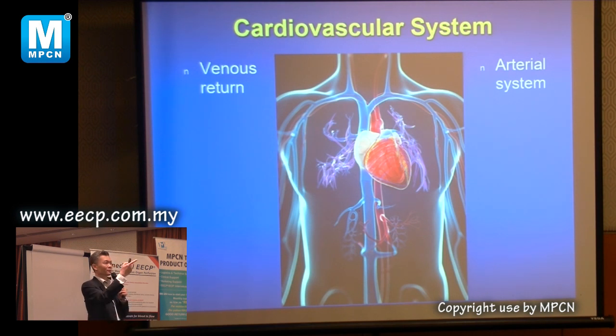After they walk in, you see them not breathless, and then check their blood pressure. If the pulse pressure has a very big difference, 60, 80, something is not right. Then you must listen for a murmur, the sound. Then also cannot do. So see the patient walking, do the blood pressure, check the pulse, and then put on the ECG. If the heart rate is irregular, with a lot of ectopics, also cannot do, because the machine is very confused to know which one is the real beat and which one to pump. So these are the basic things that you do.